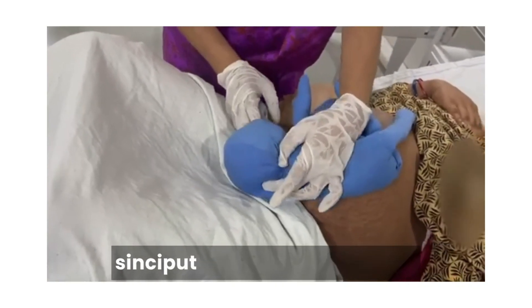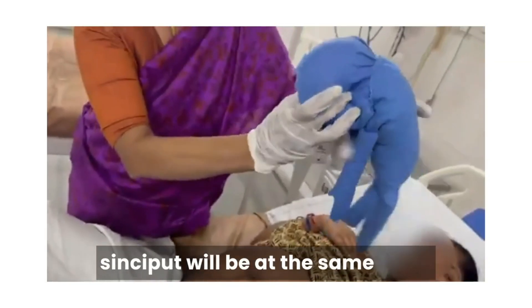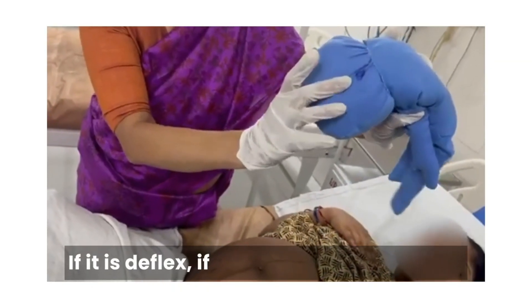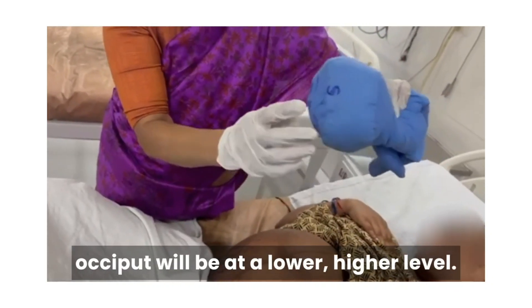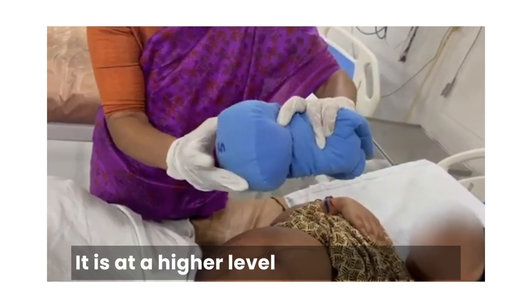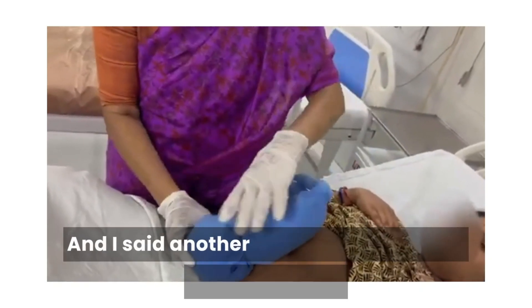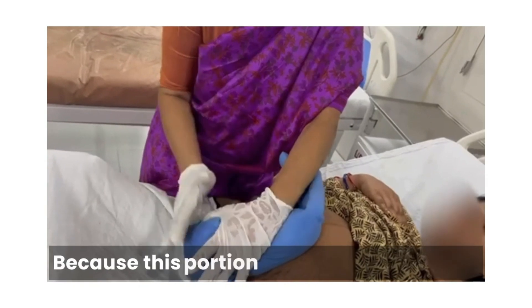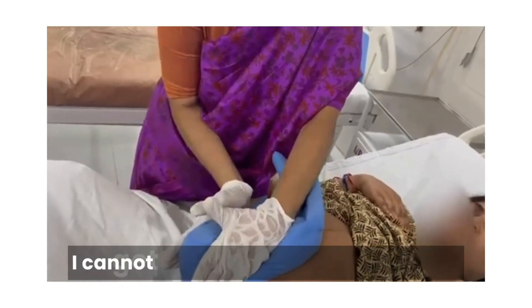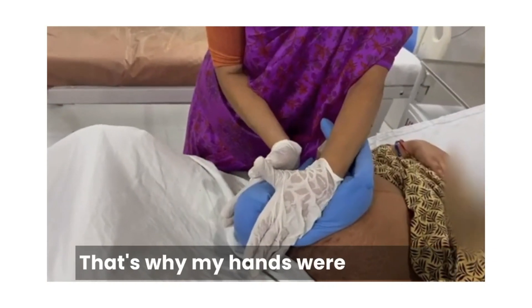If the head is deflexed, the occiput and sinciput will be at the same level. If it is hyperextended, the occiput will be at a higher level than the sinciput. This is the attitude of the baby. I also said my hands were diverging because the head has entered the pelvic brim — I cannot get below the presenting part, which is why my hands were diverging.